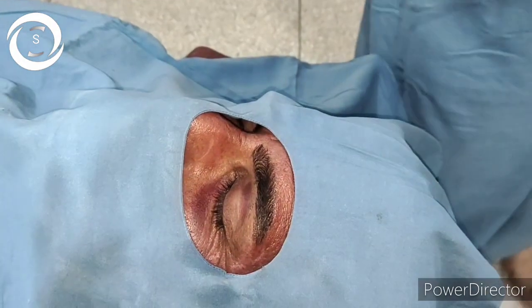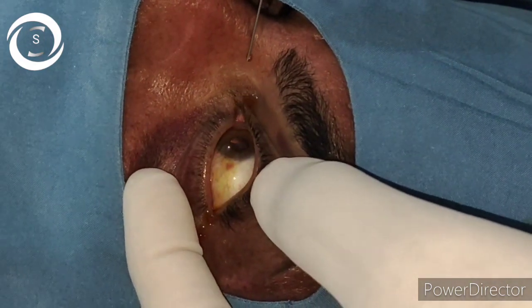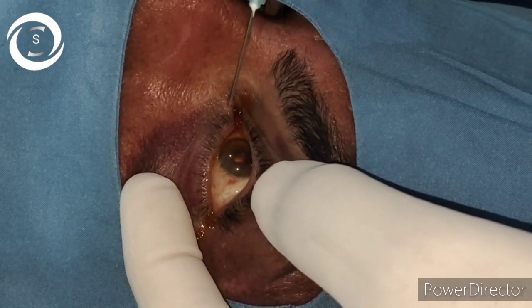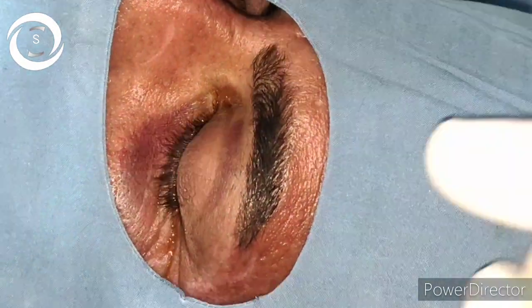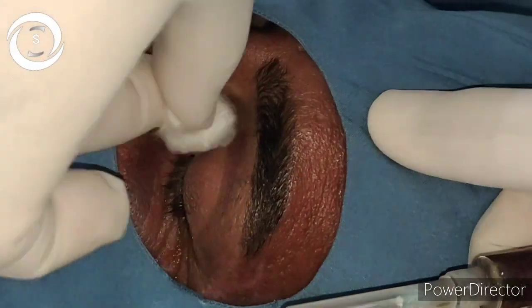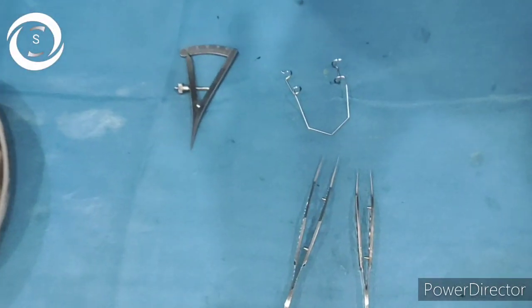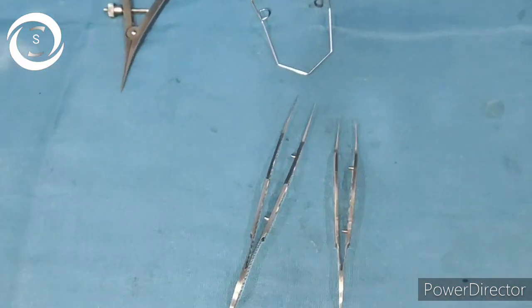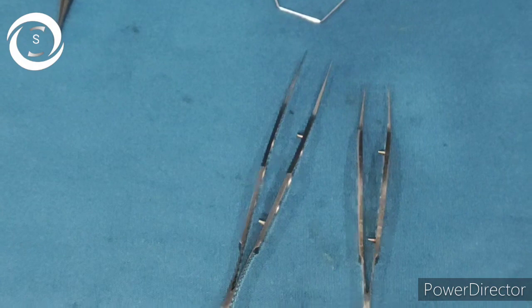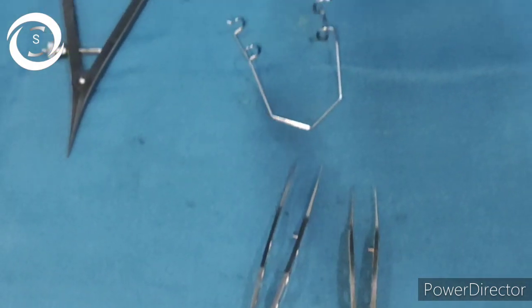Patient should be comfortably lying, put topical anesthetic drop, paint and drape. In our country, a 10% commercially available preparation of povidone iodine is present, and literature says to make it 5% by diluting it with distilled water and use it.